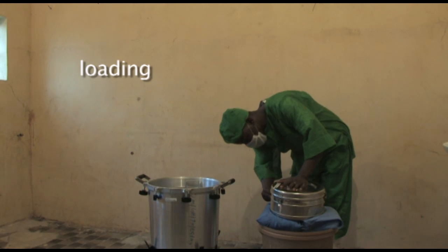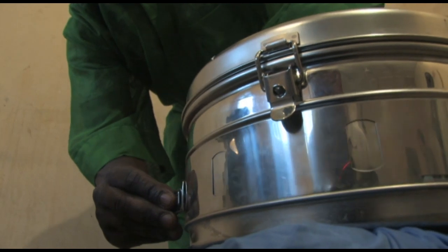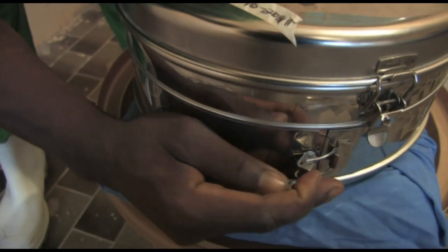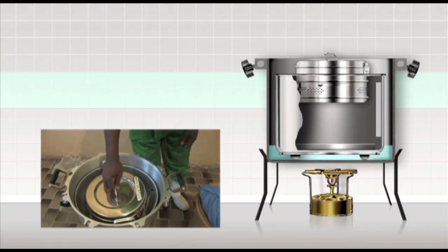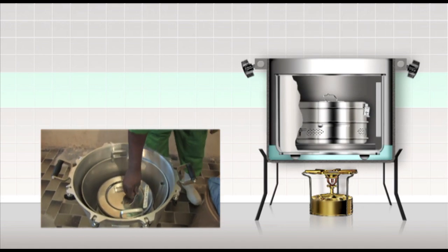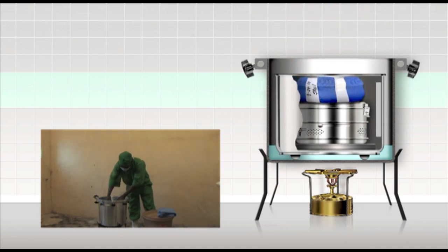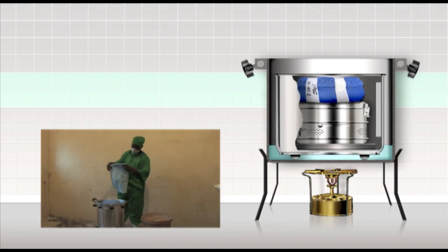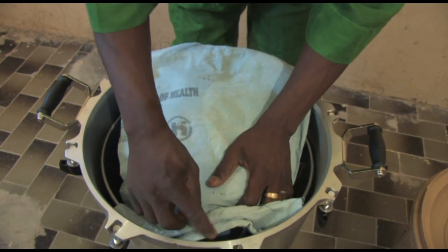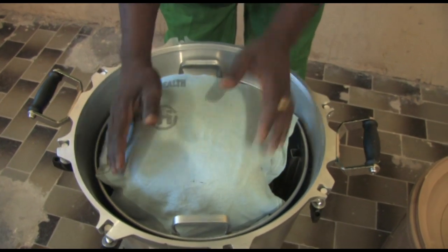The autoclave can now be loaded. The band on the sterilising drums must be opened to allow steam into the drum. Place the load inside the inner container. Remember, it must not be overloaded as the steam has to move freely and penetrate each pack. Textile packs should not be higher than half the height of the chamber. If a pack is too tall, divide the textile into two packs — this will ensure adequate steam penetration. To reduce moisture in the load, you can place a small towel or cloth on top of the packs to absorb any moisture which may drip down from the lid.